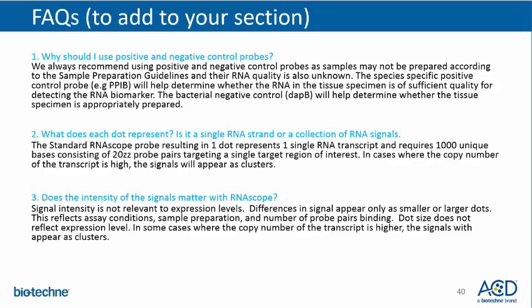People ask, what is the magnification of the slides that is used to analyze the data? Well, the answer to that is that we use 20x images to analyze the data. Another question that came up is whether the Indica software is also available for purchase. As mentioned before, yes, it is through Indica Labs, and we offer a service. Indica Labs can be contacted directly at info@indicalabs.com.